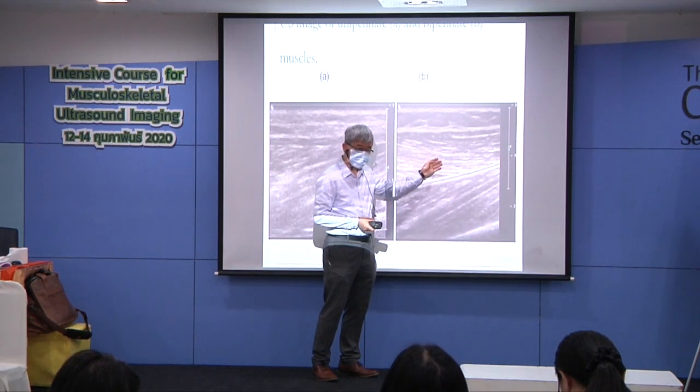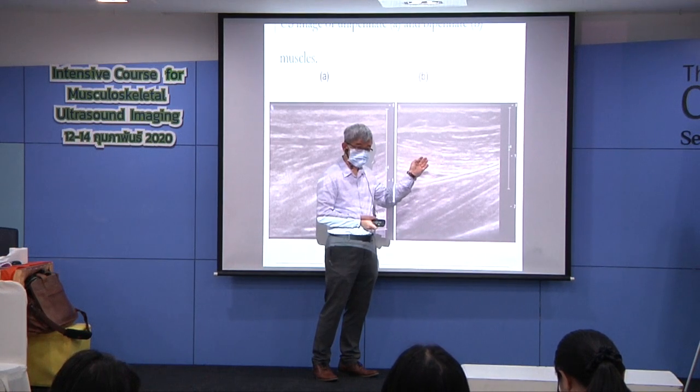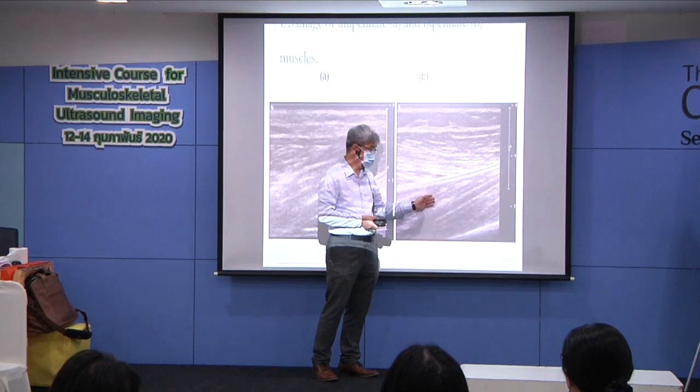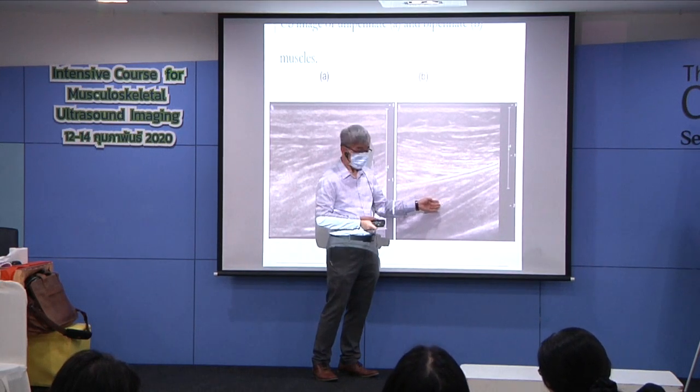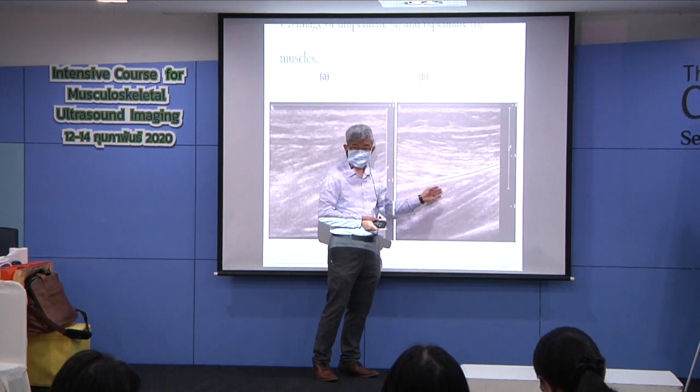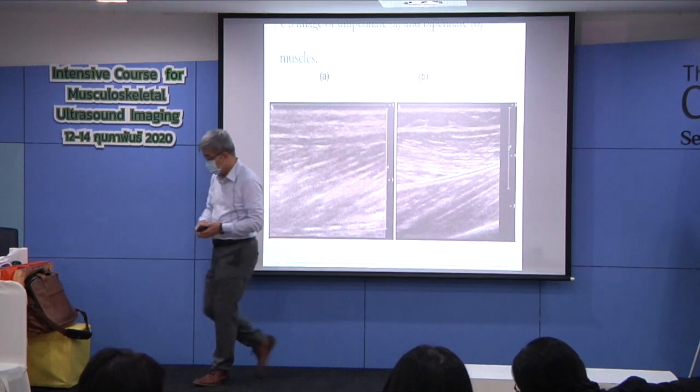Okay, superficial, we can use modality treatment for the superficial part. If the deep layer is involved, I personally would suggest electrotherapy for deep muscle stimulation. Okay.